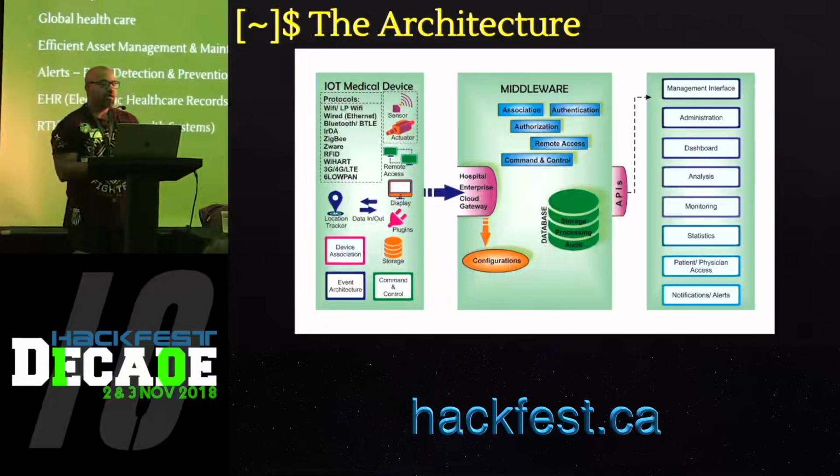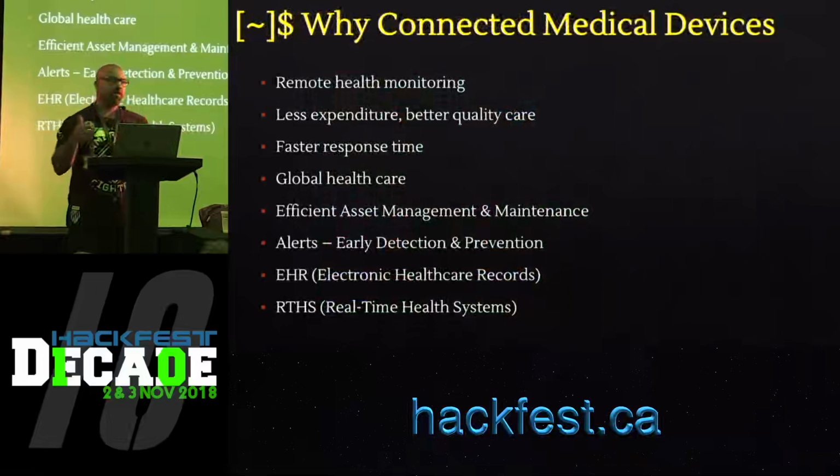So why do we need connected medical devices? There are several reasons behind it. First of all, it allows for remote health monitoring, which means that if you have a connected medical device, you won't have to go for a doctor's visit that often, which cuts down on cost and time. And not just on the patient's part, because medical practitioners are almost always overstressed, it'll also cut down effort on their side. It'll also lead to less expenditure because you don't have to visit the doctor, which might incur a fee. There could be faster response time, so the device itself may alert you for certain conditions. Doctors may take preventive measures based on your situation.